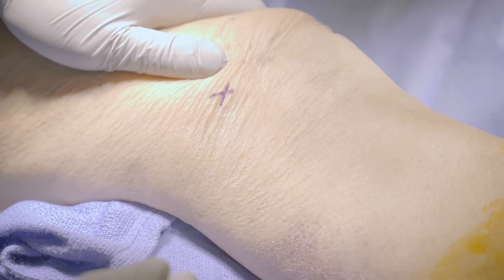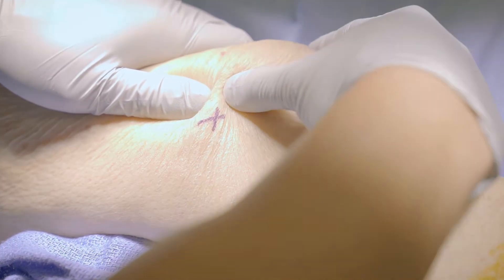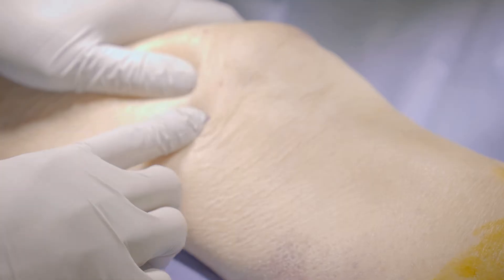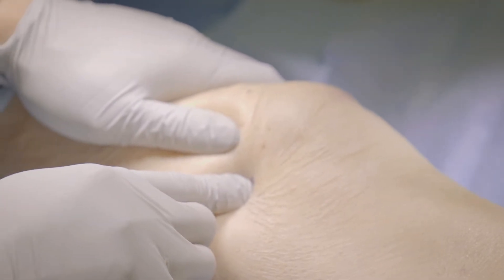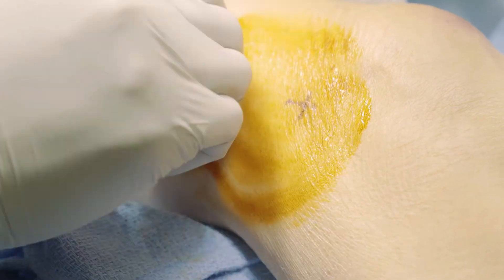To position the patient, have them flex their knee about 15 degrees with a towel roll underneath. The suprapatellar pouch can be accessed posterior to the patella, either on the lateral or medial sides. Prepare the knee with chlorhexidine or iodine and apply the sterile drape with exposure to the superior portion of the knee.